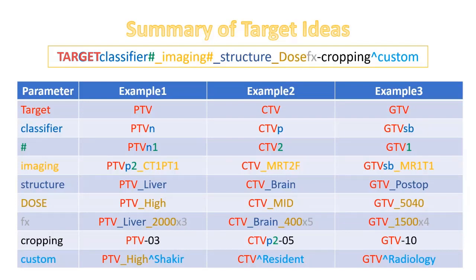What if I would like to use a custom naming, as I mentioned before? Yes, you can use this one. PTV high, this sign, and the person who has drawn it. Or if you have a resident working, you can use the same, CTV resident. Or maybe this GTV drawn by the radiologist. You consulted the radiologist at your department, and he showed you how to draw this type of GTV or PTV. You can use also this terminology.